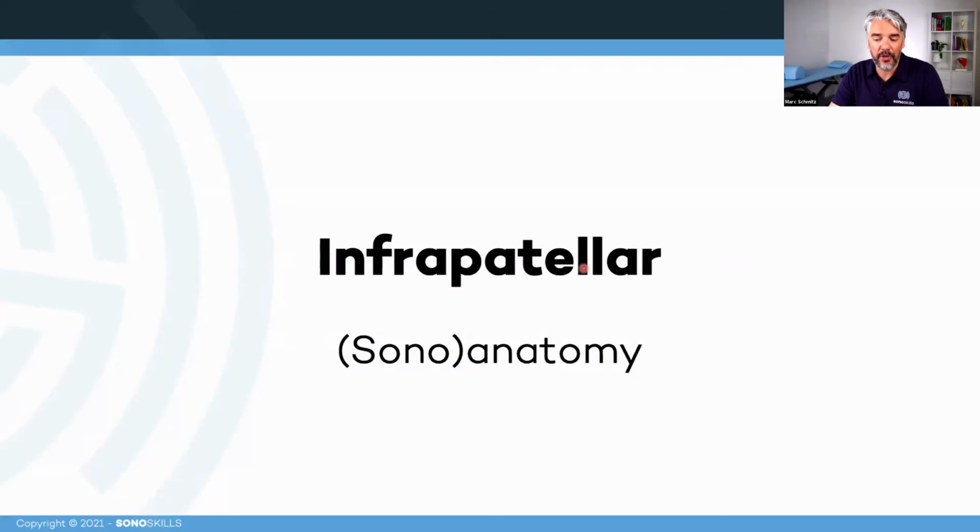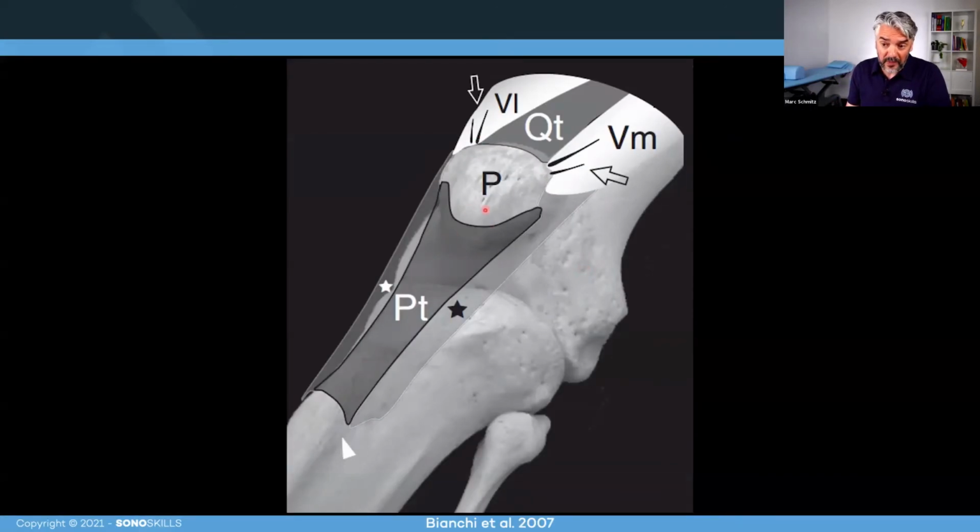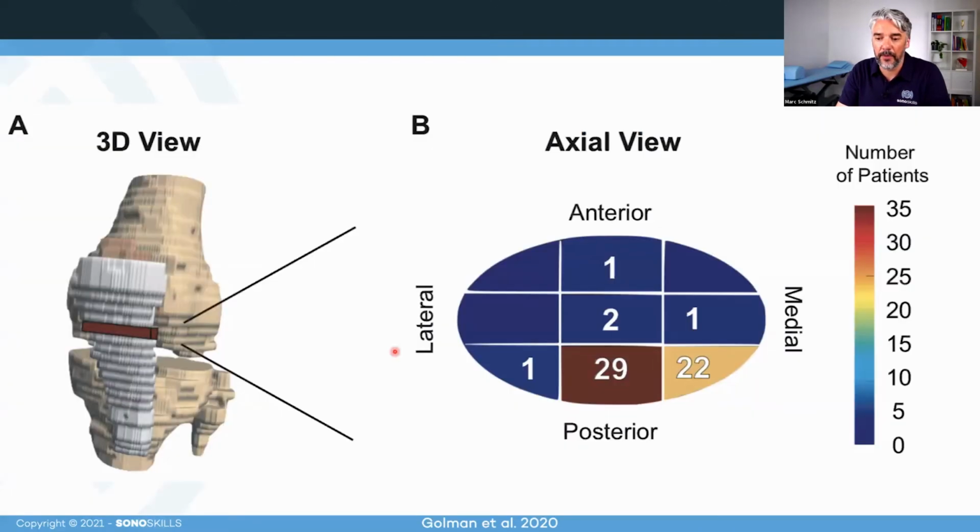So the infrapatellar region is the last region I just want to touch on today. So this is the patella, and the infrapatellar region consists, for this talk, mainly of the patellar tendon, which originates from the medial and lateral parts of the patella. So don't forget to scan these as well. So not only in this deep portion of the patella, but also on the sides. And then it's quite broad there, and then it goes all the way distal to the tibial tuberosity for its insertion.